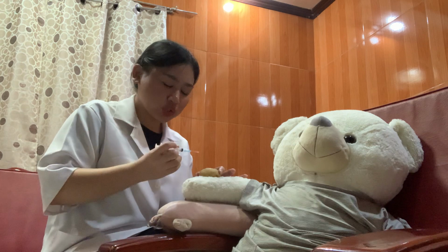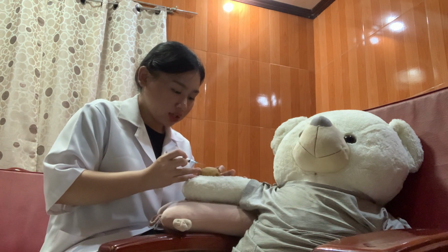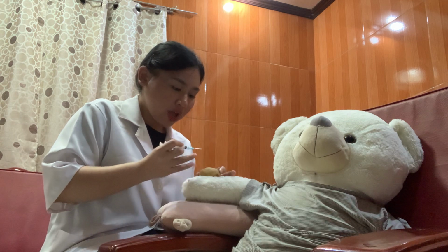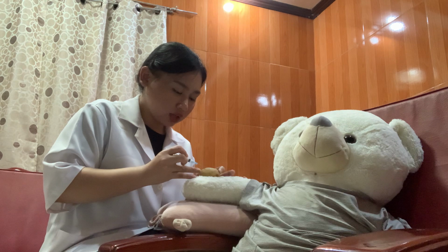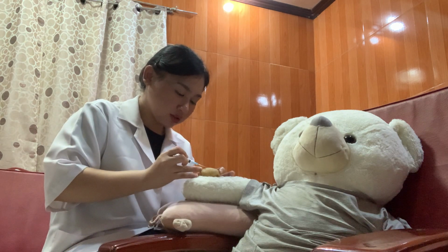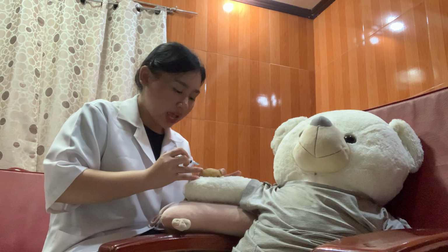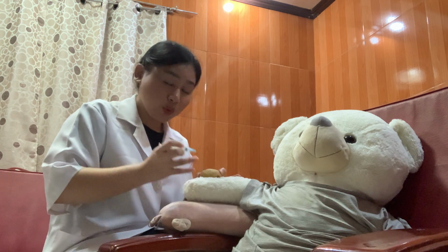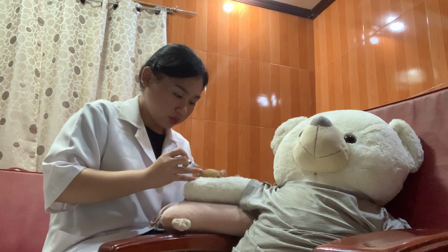Holding the syringe like a pencil, with the bevel facing upward, approximately 45 to 60 degrees for radial and brachial artery, while for femoral 90 degrees is used.